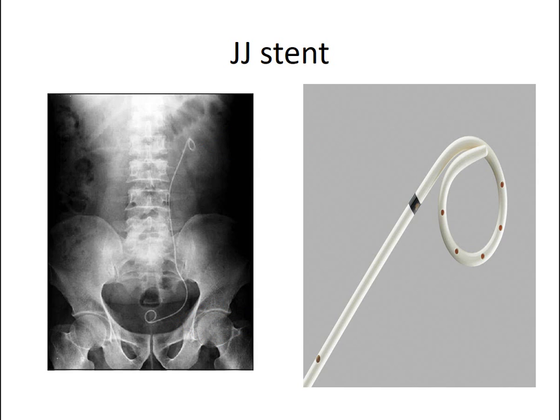The curls are a double-edged sword. They hold that stent in position so it doesn't migrate down or up. Typically, the risk is migration down with the flow of urine from the kidney down the ureter into the bladder. However, you can imagine when you empty your bladder, that little curl bangs into your bladder or pulls on your kidney and can cause some pain associated with it.